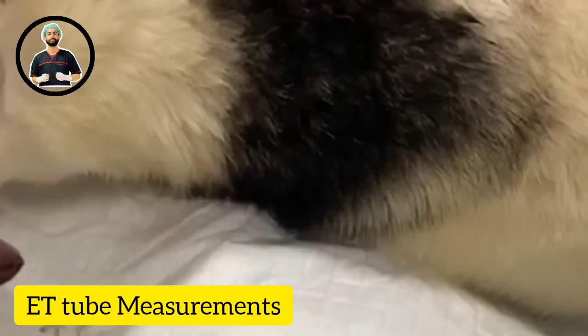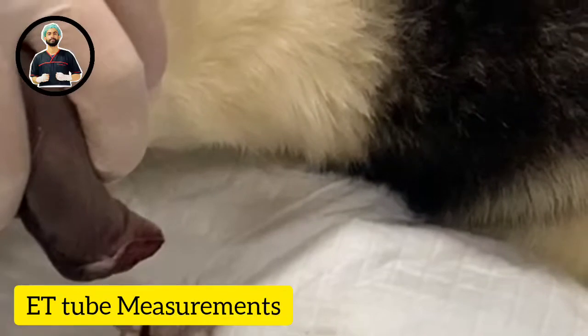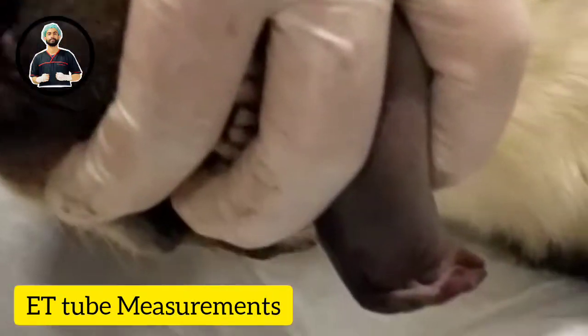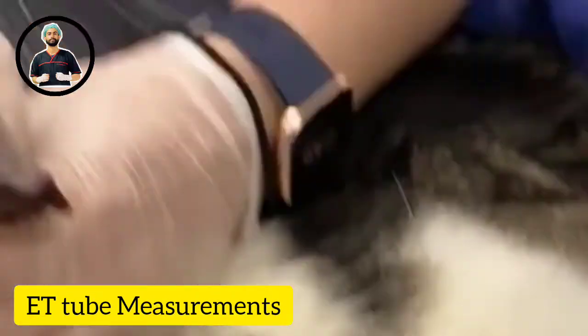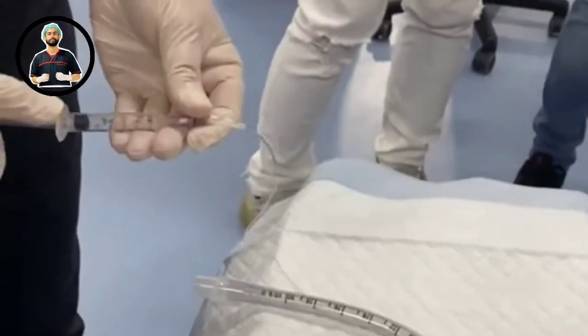Another way that my colleague uses, which she swears by, is half the width of the nose — so it's based on the septum. It's another way to measure. Sorry it's a bit hard to see — roughly half the width of the nose.